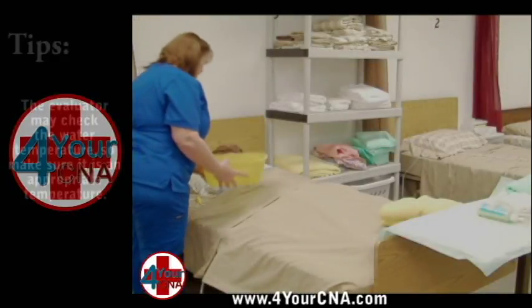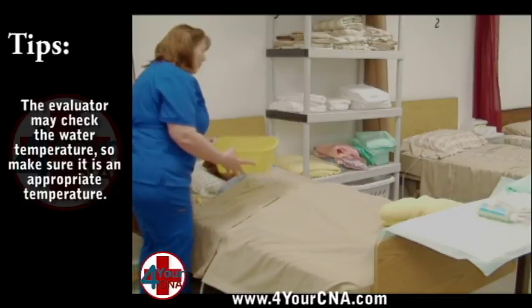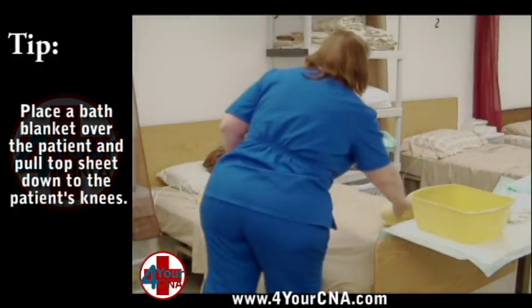Ask the patient to check the water temperature. For the test, the evaluator will be checking the water to verify the appropriate temperature. Place the basin of water on the overbed table. Obtain a pair of gloves.